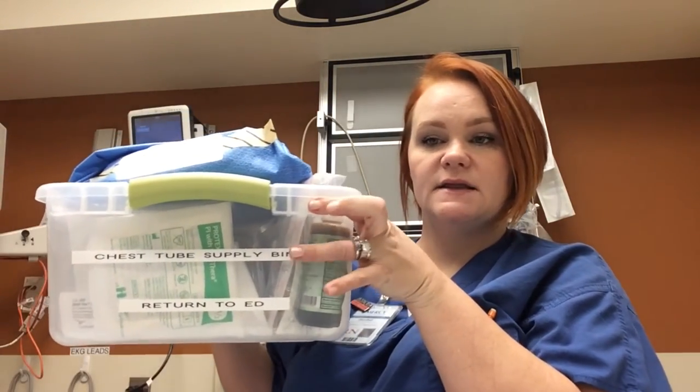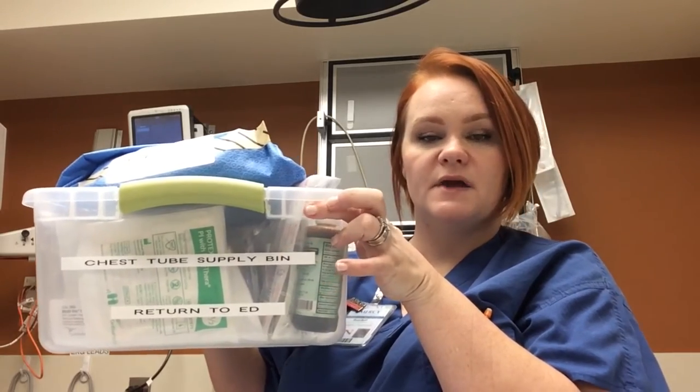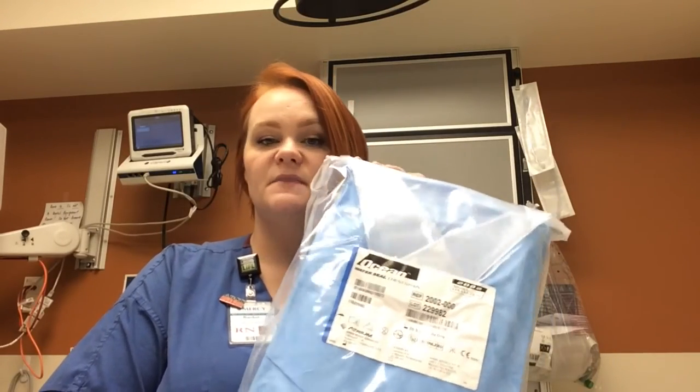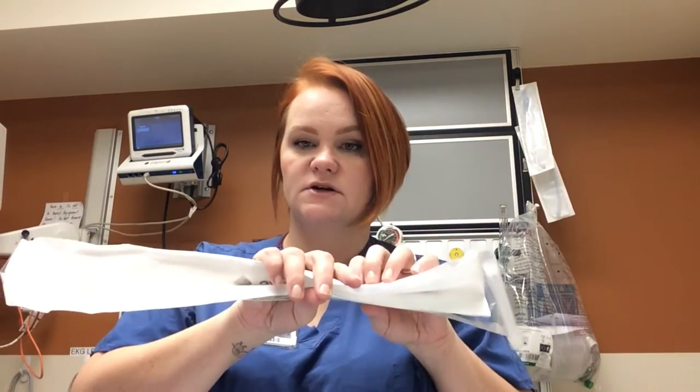For that, in the emergency department, we have three chest tube trays set up. They look like this, and they say chest tube supply bin. They're located in the trauma cart. There's two of them there, and in room two. So if a physician says we're going to put a chest tube in for whatever reason, you would just grab this bin, and you would also grab the water seal chamber device that usually sits next to the bin, and then the lot of trocars that are rubber banded together that again sits next to the bin.